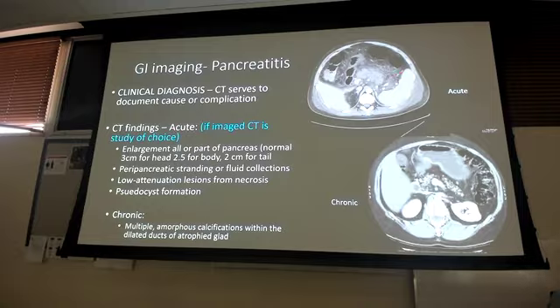But if I gave you the picture with a vignette that describes a patient we have concern for pancreatitis, then you use the vignette to go, hey, I've got these abdominal issues that we've talked about in this course. There's plenty more abdominal diagnoses we haven't talked about, but this fits these things. That's kind of on my differential. Now I look at the image and do I know that's the pancreas? Maybe not 100%. But if I know my anatomy and I go liver, spleen, oh, epigastric. Okay, that's the epigastric region.